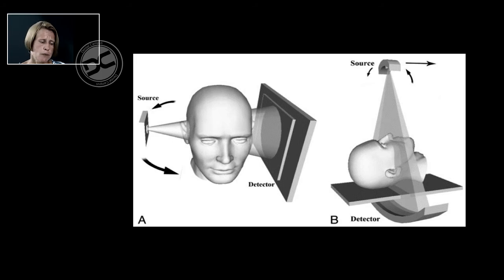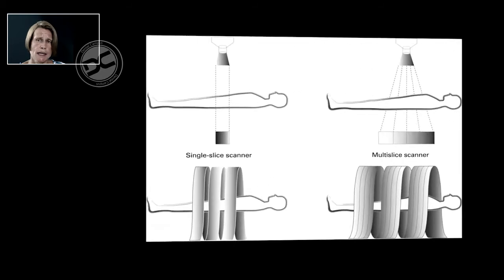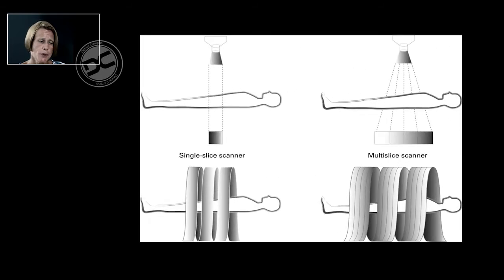Yet nowadays, when you compare a single slice CT scanner with a multi-slice CT scanner, you will notice that while in the past one rotation meant one single slice of the patient head, a multi-slice scanner like the present one showing 4 slices next to each other can scan thus much more information at the same moment.